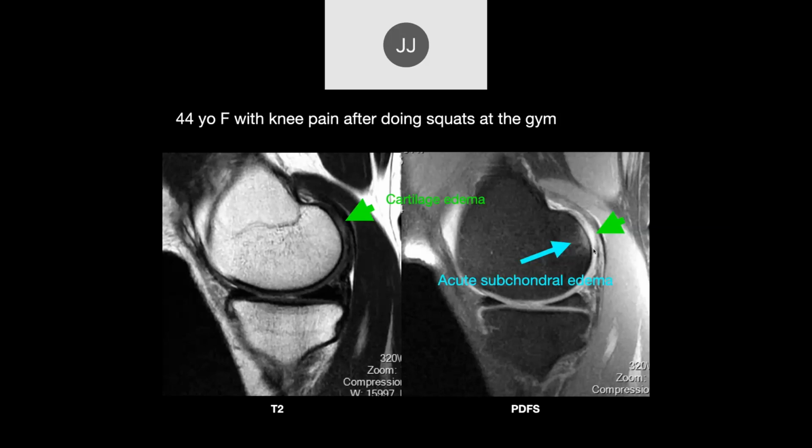I'd say probably 90% of the time you'll have difficulty. Maybe 80%. I can't give a number, but you can see that area. Depending on if you have a 70-degree scope, you can see quite a bit around a corner. Now, what we really need is a scope that bends and instruments that bend, and then I think we'd be better off. Okay. So here we can see the bone edema and the cartilage edema.